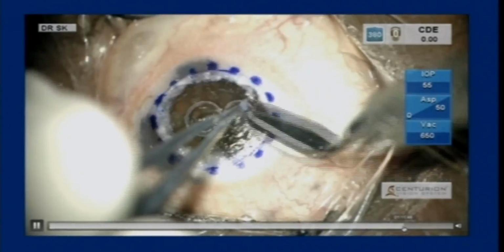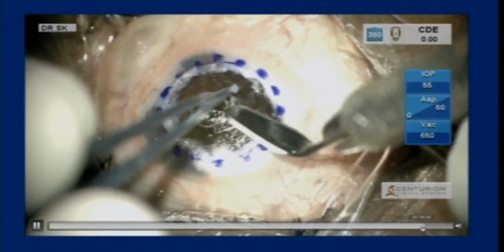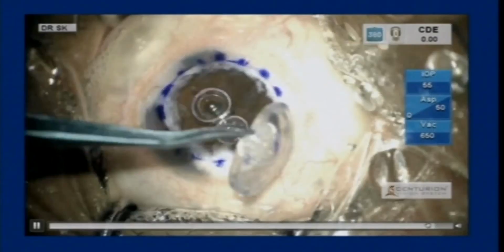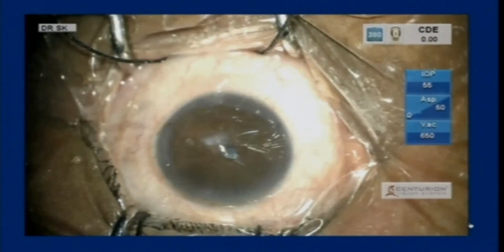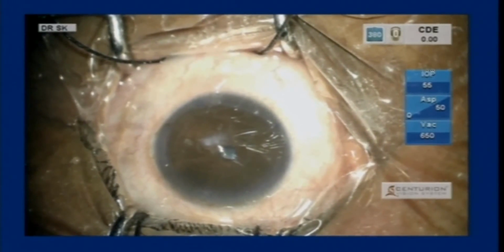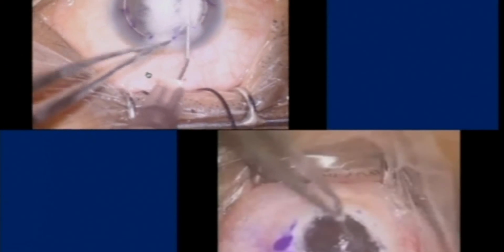And the patient did very well after the procedure. It is a pre-Descemetic DALK. I could not reach up to the Descemet's. Another case, this is a case of advanced keratoconus, wherein this is a post-healed hydrops.